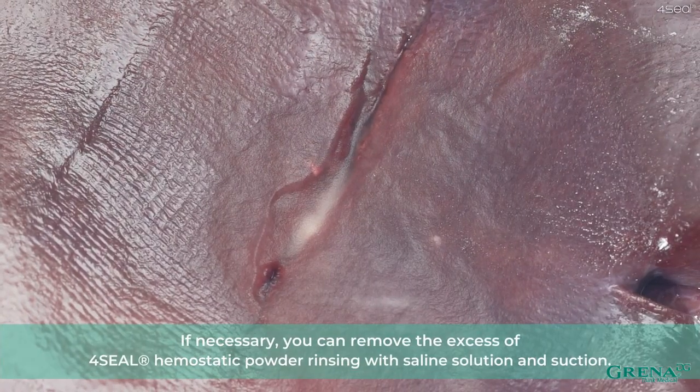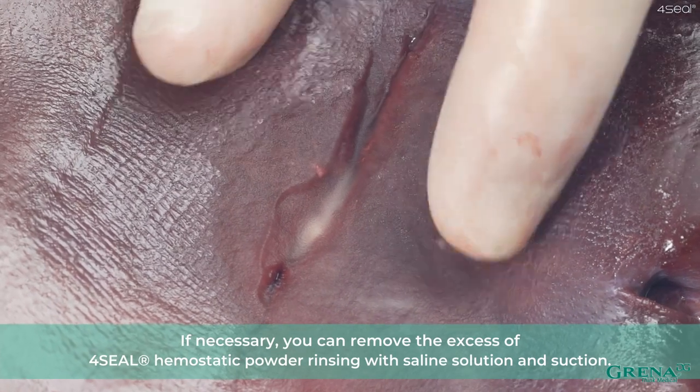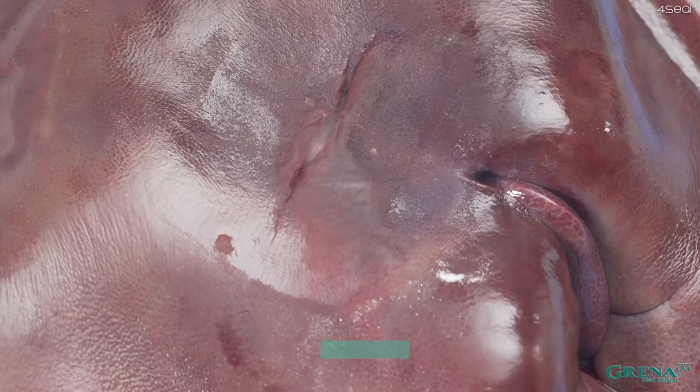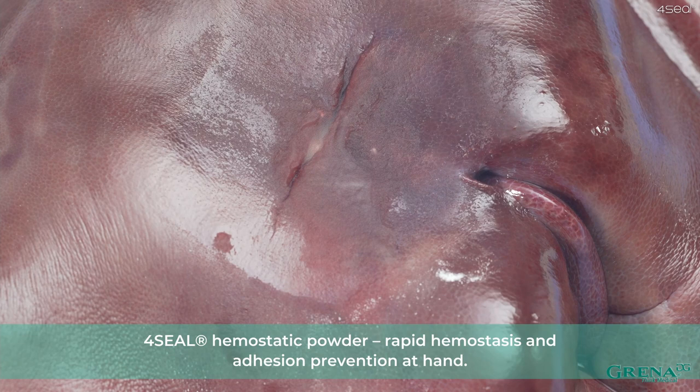If necessary, you can remove the excess 4Seal Hemostatic Powder by rinsing with saline solution and suction. Finally, a semi-solid gel structure that stops bleeding and seals the wound is expected. 4Seal Hemostatic Powder — rapid hemostasis and adhesion prevention at hand.